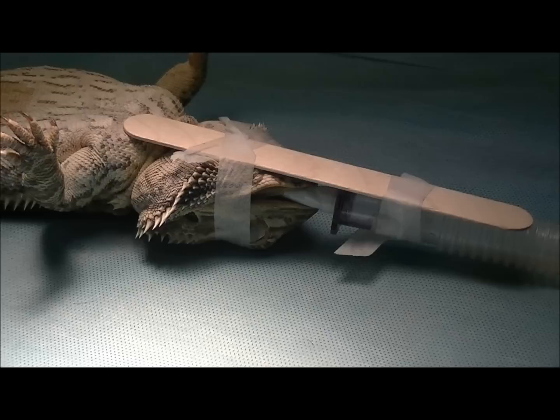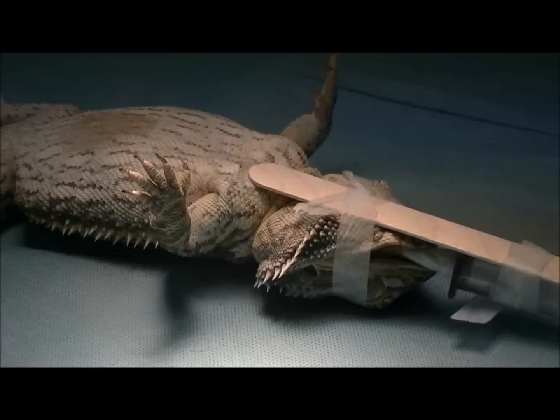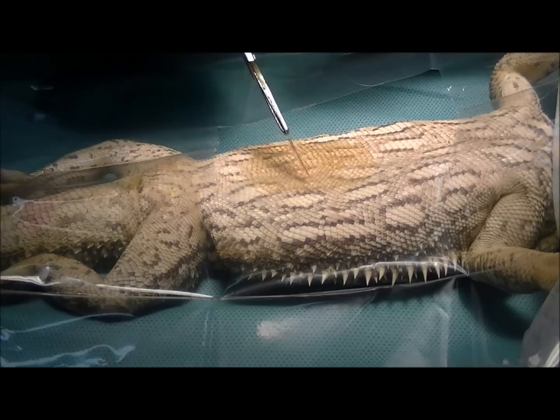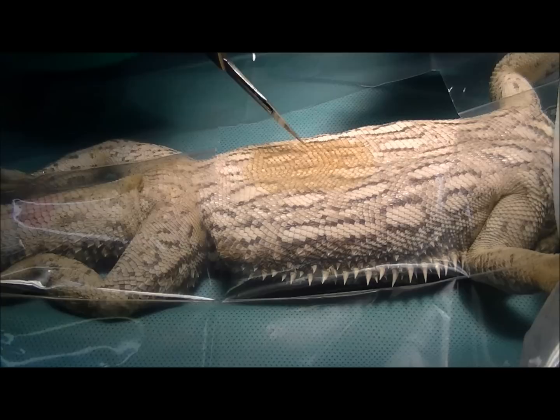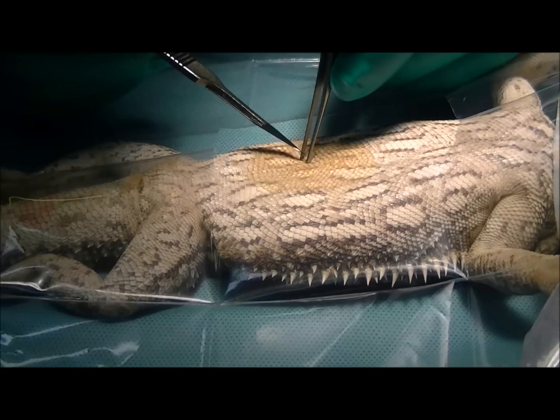She's now anaesthetised and hooked up to the anaesthetic machine. As you've seen in other videos, we use a tongue depressor to secure the ET tube. She's on her back in position ready for surgery — my nurse Carla is sorting out the anaesthesia in the background. We'll prep her for surgery and make an incision in the belly to take out the ovaries and uterus. Unlike dogs and cats, these guys have a large mid-abdominal vein, so we're going to come off to the side by about a centimetre and make a small incision — probably about three centimetres long to give us good visualisation. We should be able to get both ovaries through that incision.